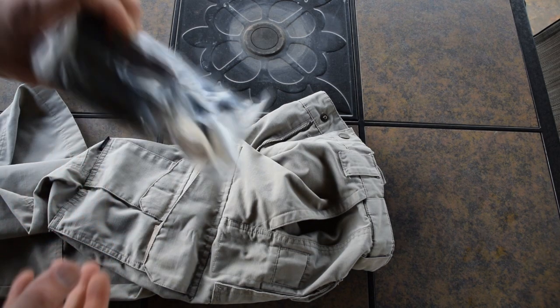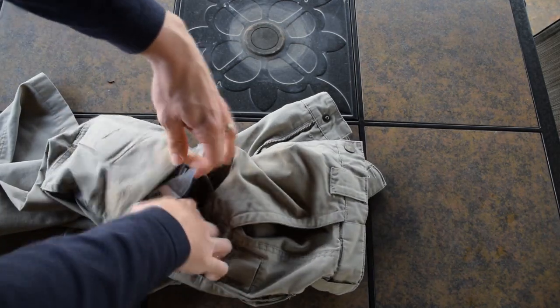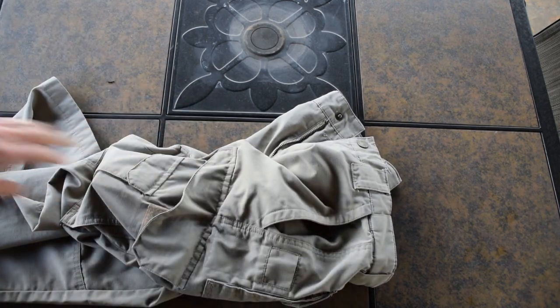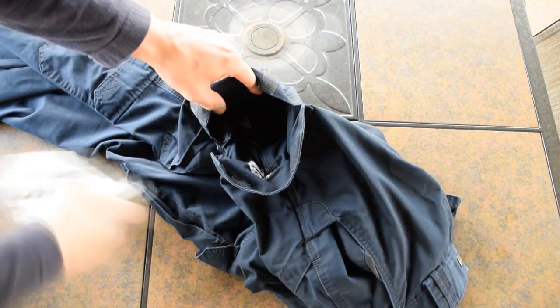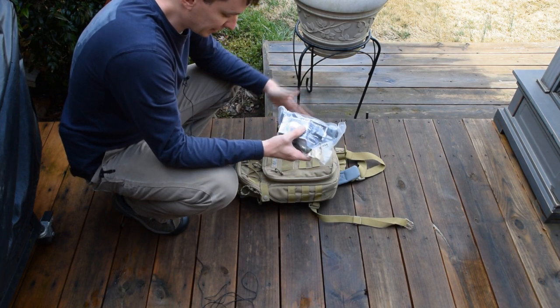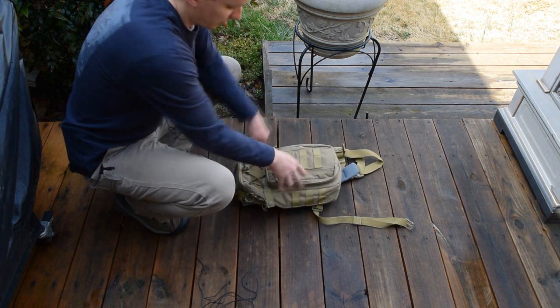Here's a pair of TrueSpec pants — something that you would wear at the range while you're training. The Skinny Medic Pocket Kit will fit down in this BDU pocket. Here's a pair of 511 EMS style pants, so you can wear your trauma kit while you're on duty. We could also be simulating a range bag, backpack, school backpack, or day pack — this Skinny Medic Pocket Kit slides in perfectly.